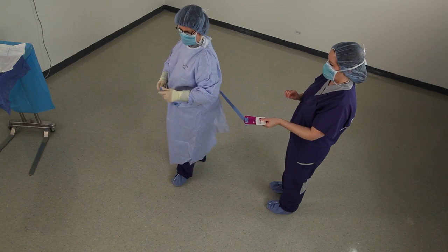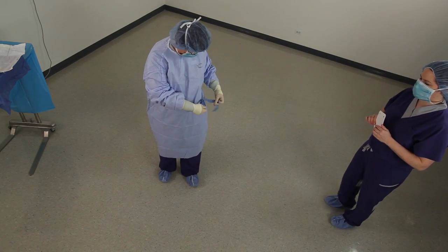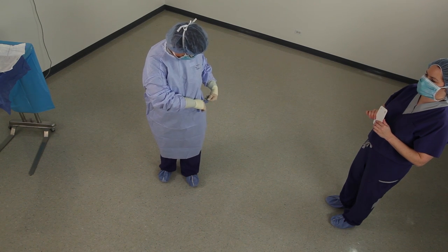The Cardinal Health Surgical Gown Offering includes a wide variety of gown sizes and AAMI protection levels to suit end-user needs.